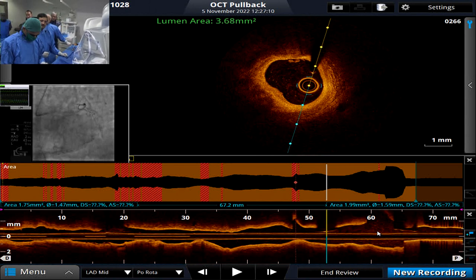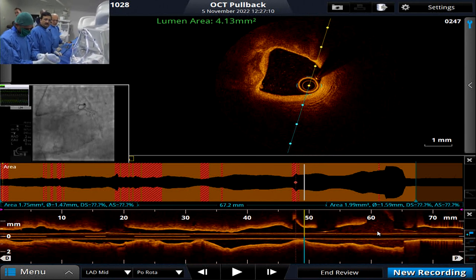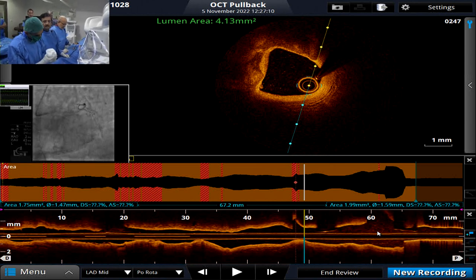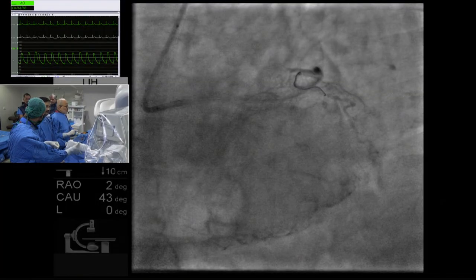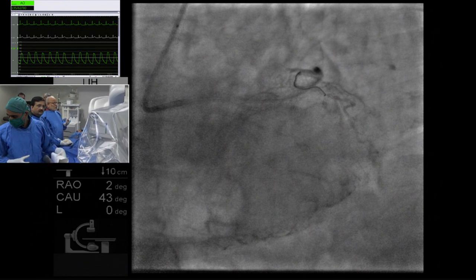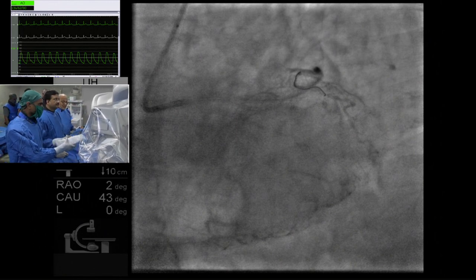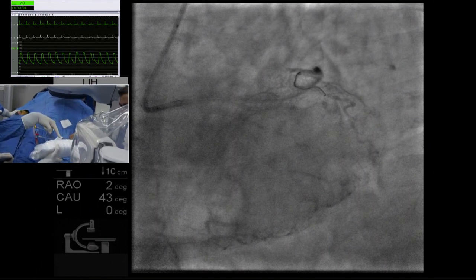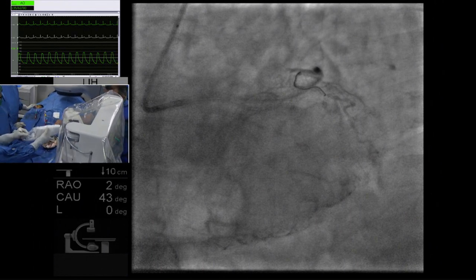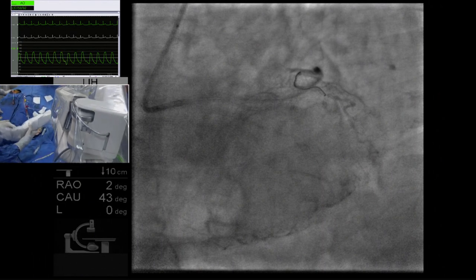Hello, sir. My question to Dr. Tejas Patel and all other panelists: regarding use of NC balloon or scoring cutting balloon after rota, could we use OPN balloon? It's also available in our country, in Bangladesh as well. Yeah, OPN balloon is for very high pressure dilatation. It is good at certain places, but you have to be careful, because in our arteries the perforation rate is higher, as most of the literature is Western world literature. So we have to be careful about it, but yes, OPN is a good balloon, and in selected situations it can work very well.